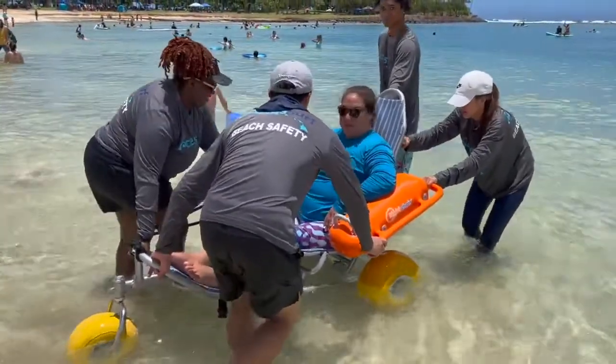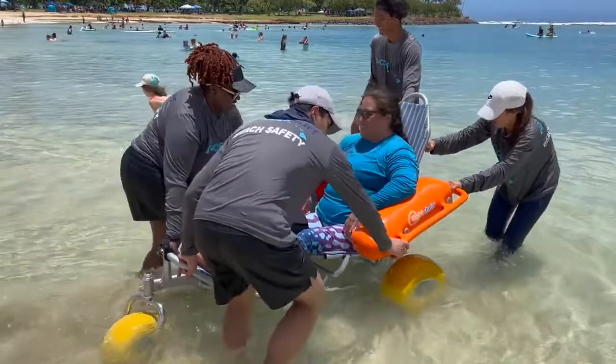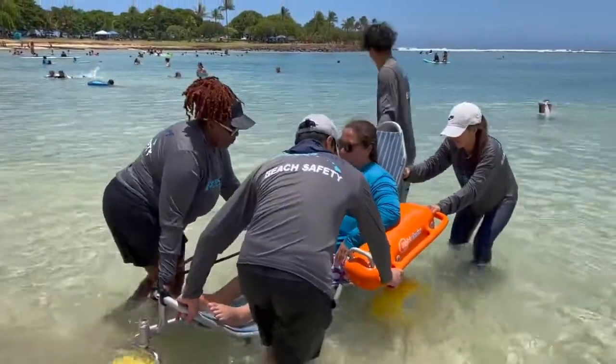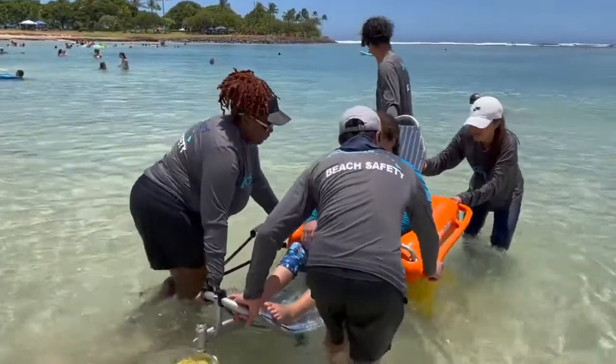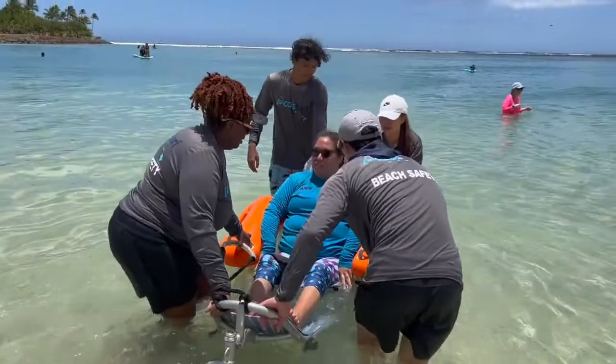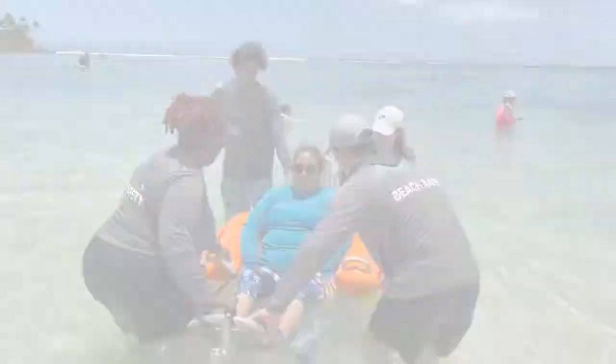The volunteers will continue to back the chair into the water until the participant is waist deep and the chair is floating. Once the Mobi-chair is in the water, it will float and move with the waves. The team should always hold on to the chair and keep it as stable as possible when in the water.